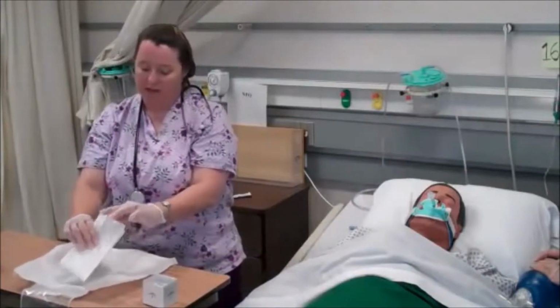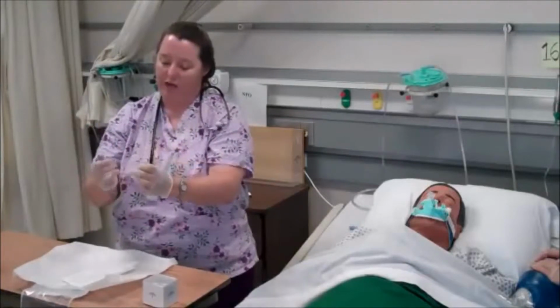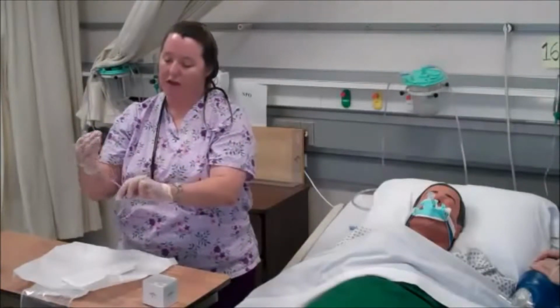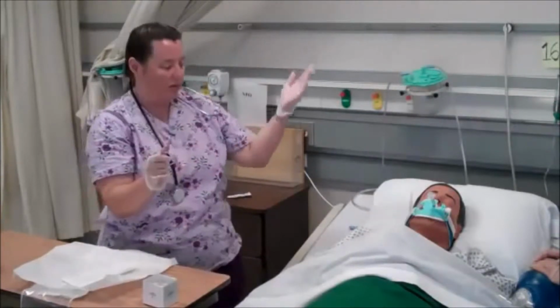I am now going to touch the sterile catheter here. I'm going to go ahead and just loosely gather around my hand here to get a little bit more flexibility. This hand will now be sterile. This hand is going to become clean.